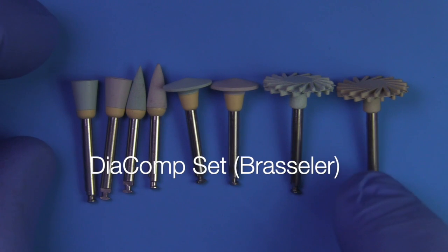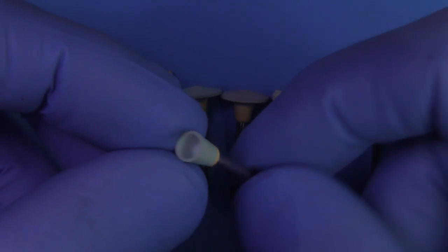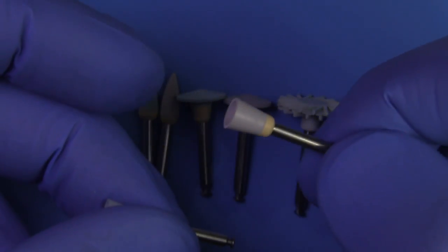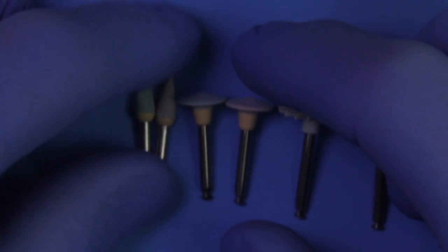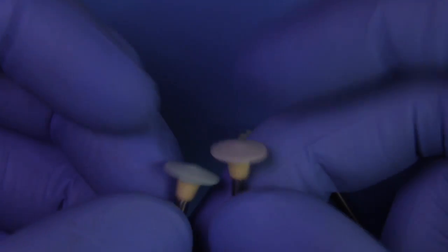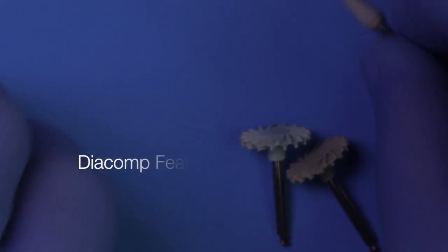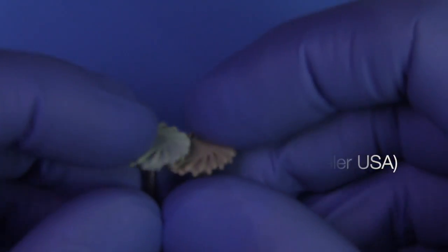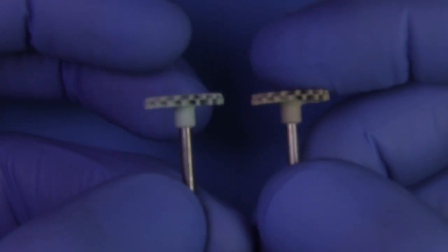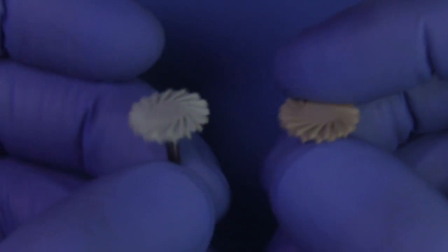So these are the Diacomp instruments. Step one is a green and step two is a gray. Each one of these has a two-step process. You'll probably want to use these with water — a little bit of water is going to decrease the heat. And then these are the Feather Lights by Brassler, and these are the final touch to give you an incredible high luster when you're finished with the contouring.